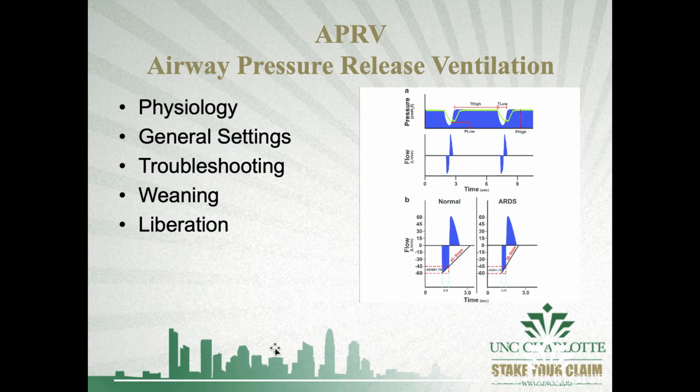Again, there is some nature of arbitrary conclusions that are drawn from these settings, but these are like your general settings if you set a patient up on conventional ventilation, okay? So obviously you adjust from here, but these are safe general settings and you assess from this point.